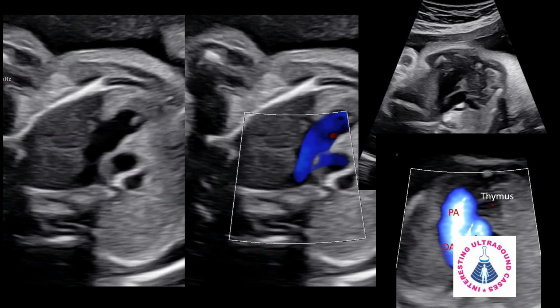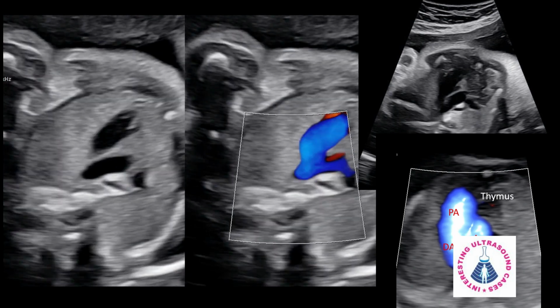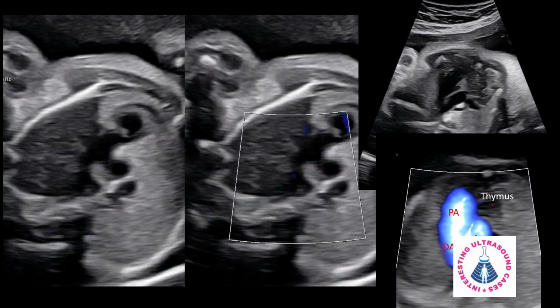We should always see the three vessel trachea view with color, and both the vessels show the same color.